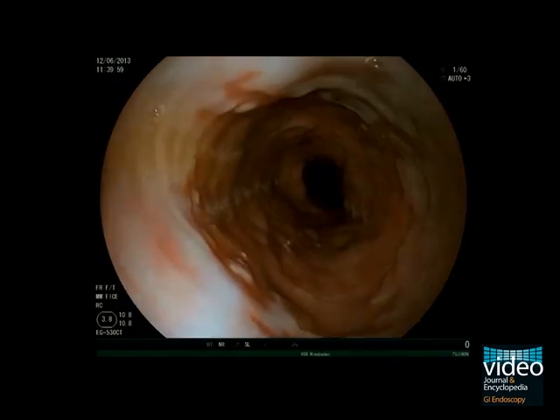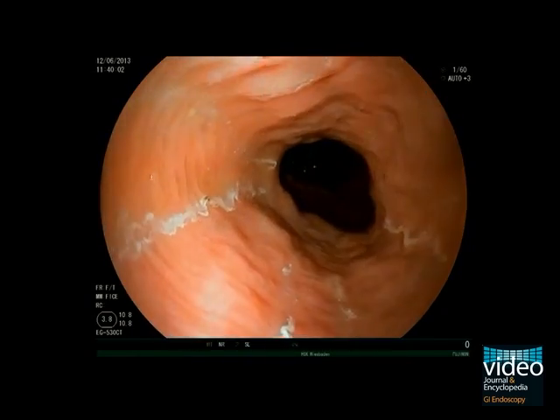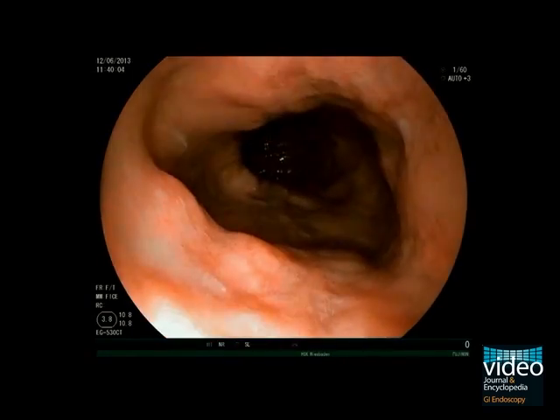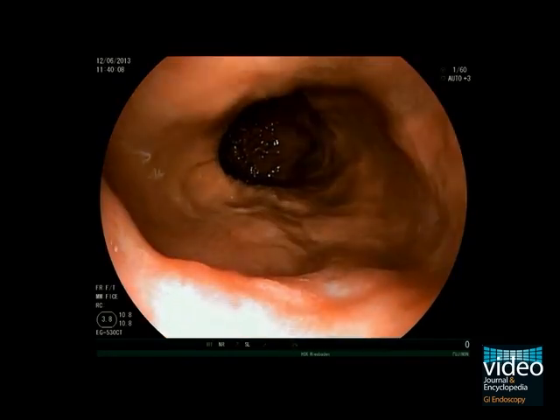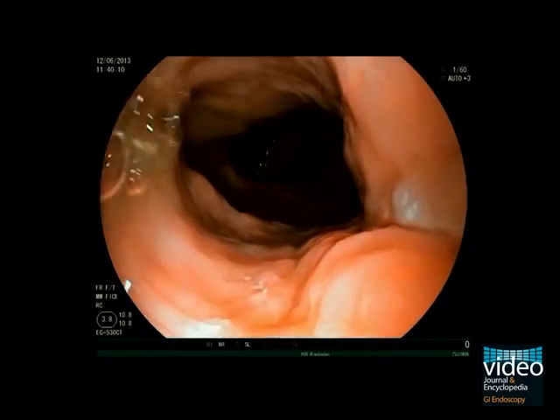This is a second case of a patient with known Barrett's esophagus. The esophageal wall is widely capped with the metaplastic mucosa. Obviously, this is a long segment Barrett's esophagus as it exceeds three centimeters in length.